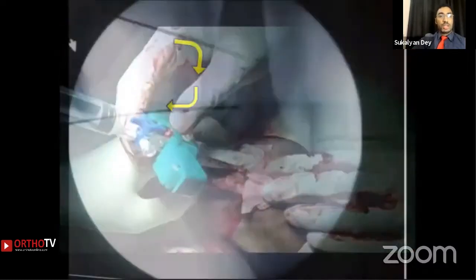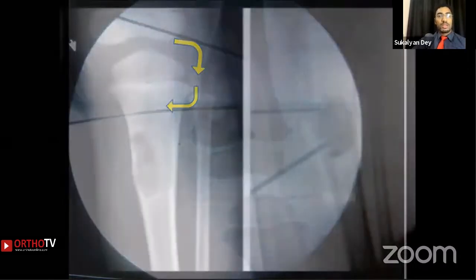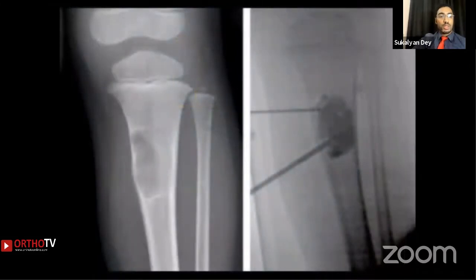It is also a good idea to use 2 needles, one for the aspiration and another for the injection, which leads to an effective displacement of the cyst fluid and is replaced by the sclerogent fluid. Sometimes dyes can also be used for better delineation of the cavity.